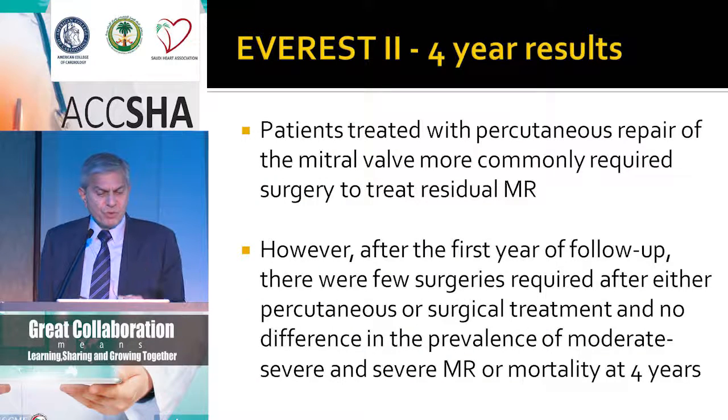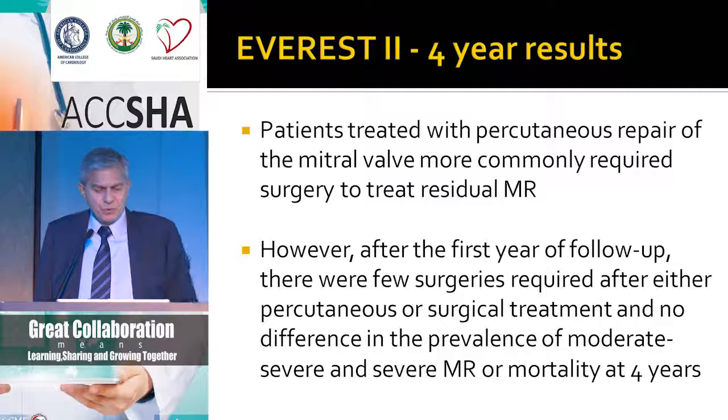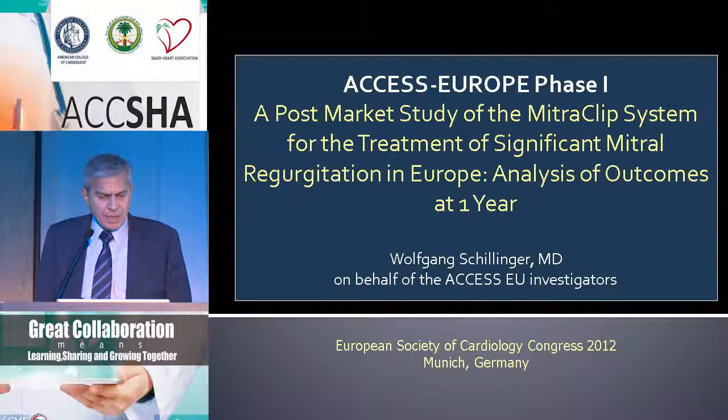So patients treated with the percutaneous repair more commonly required surgery to treat residual MR. But it's important to say that after the first year of follow-up, there were few surgeries required after either percutaneous or surgical treatment, and no difference in the prevalence of moderate severe MR and the mortality at 4 years, as I've shown you.